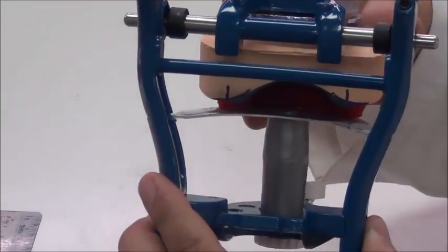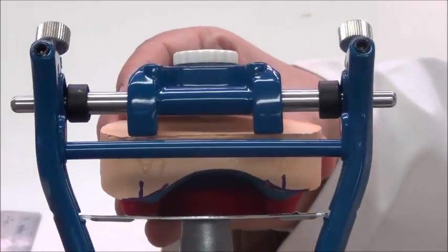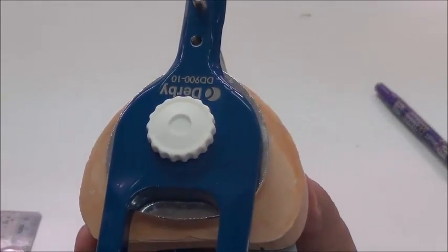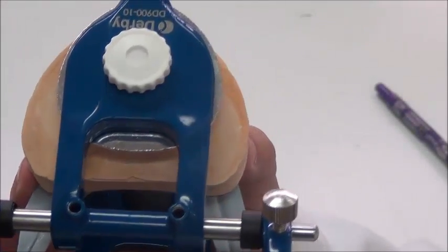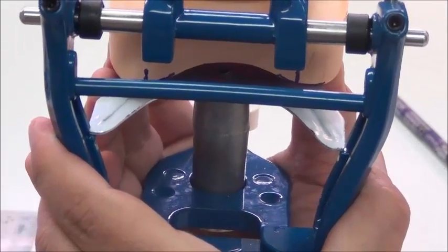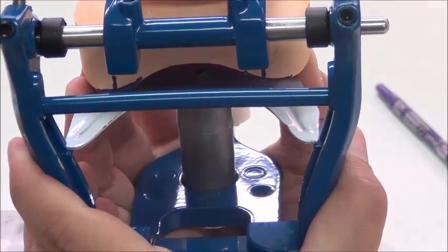So if I come with a closer view, I'm comparing these with the lines, so I'm just making sure that my cast is oriented on the articulator. I also want to make sure where is the position of the cast in terms of the upper member, so I'm going to go a little back until I reach the posterior point, where anteriorly the anterior wax is on the midline of the jig. Posteriorly, I'm looking that the distance of these two lines from the vertical component running down the articulator are centered. I know they shifted a bit, so I'm going to put them back.